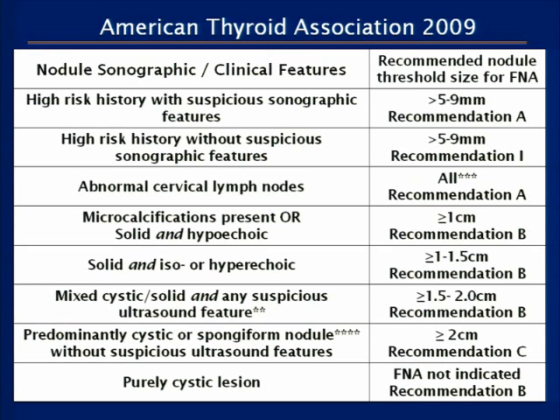So we are just trying to make this decision for biopsy, combining everything that we know, history, size, ultrasound features, to try to have a more practical and thoughtful approach to biopsy. If something is a purely cystic lesion, no solid component at all, FNA is not recommended for pure cysts within the thyroid.